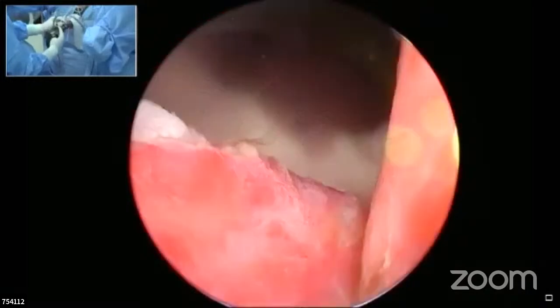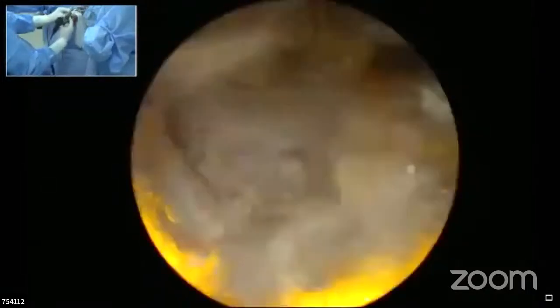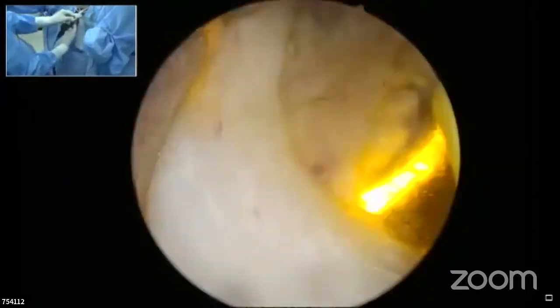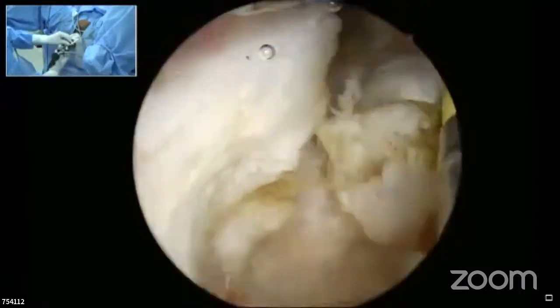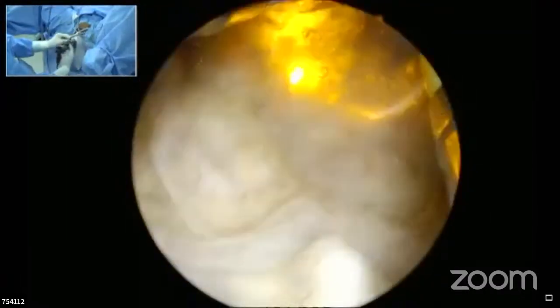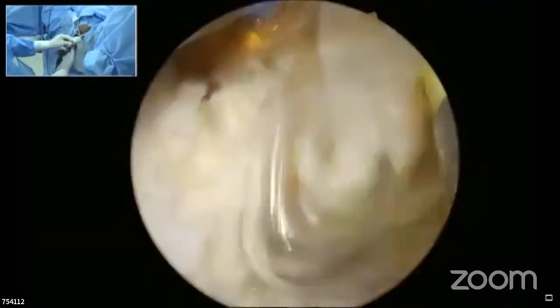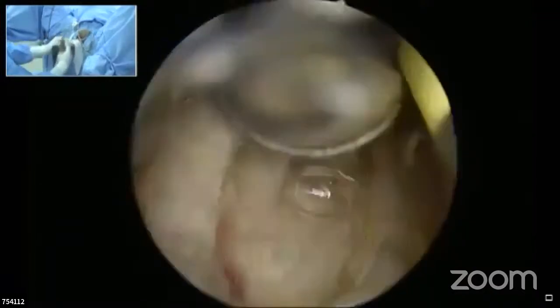But actually, to get the effect of the bipolar, you need to resect at a much lower speed than you do in the monopolar. Okay, sir. Because at this speed, I think even in monopolar, you can resect as well. Sir.